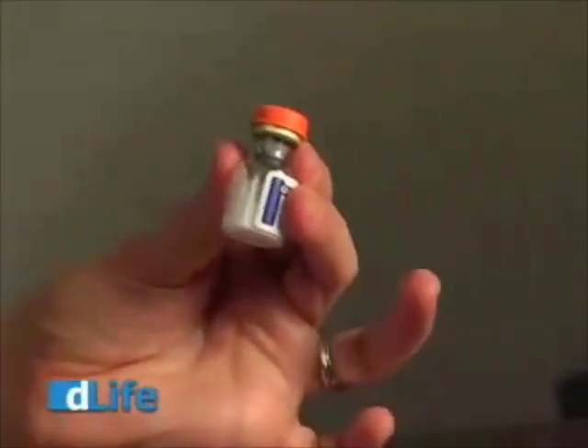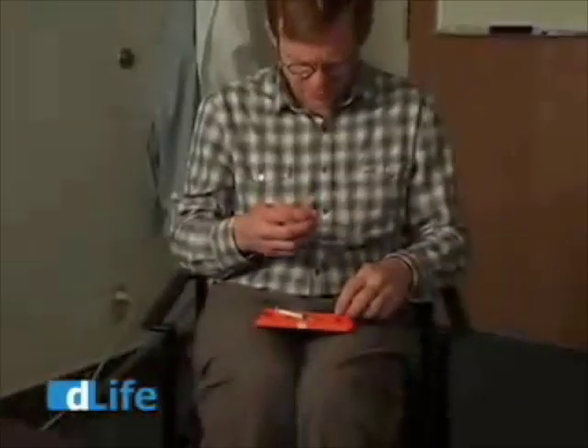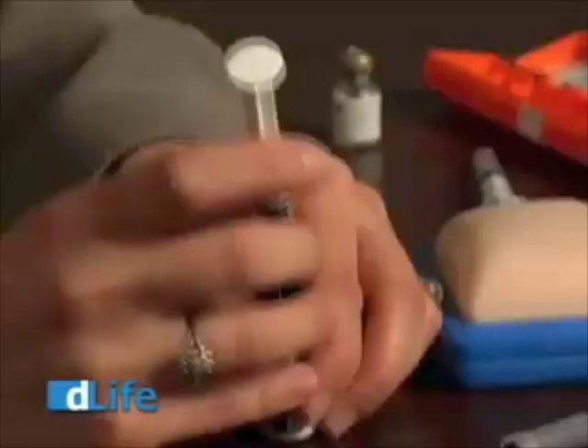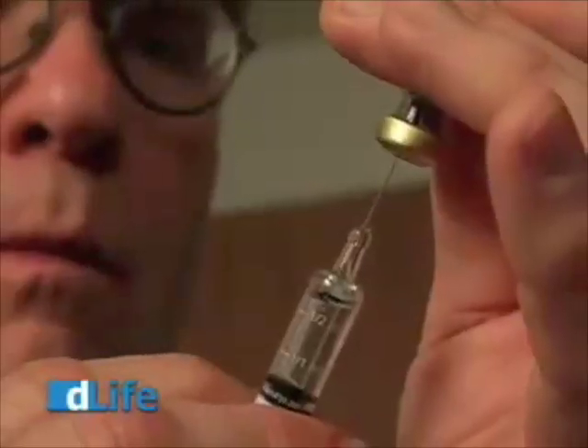So the first thing that you do is you take the vial out — it has a disc of powder — and you take the cap off. Take the syringe and take the cap off. Inject the liquid into the vial of powder and you want to mix. Shake it up like that.